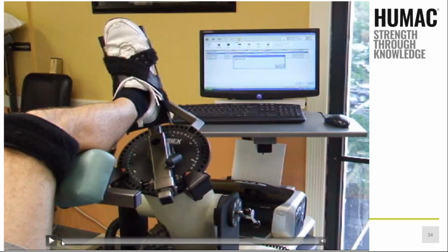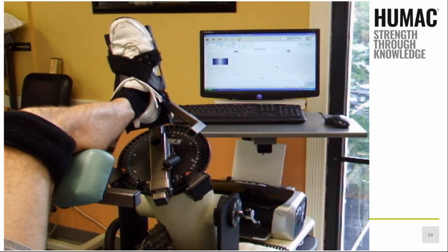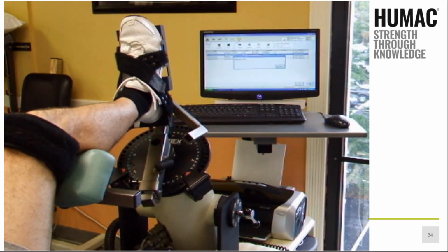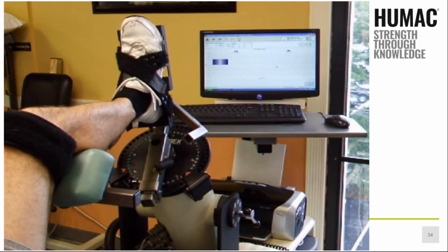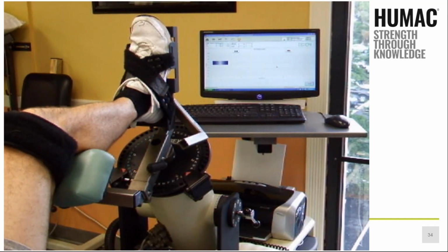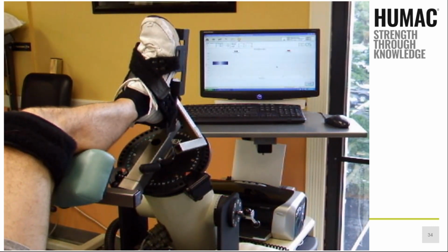And again, ankles are another one. The lower extremity, the foot and ankle, is a big love of mine. I love working foot ankle. So we put a lot of our ankles on here. And it's one thing that I see that people don't do early on. So again, not just because they're the biggest, strongest guys get on here, but we put our older patients on here. How can you tell this is an older patient right off the bat? Because you're never going to get a young kid to walk into your clinic wearing that kind of shoe. That's how you know. But isometric stabilization early on in our rehab process, extremely important for us.